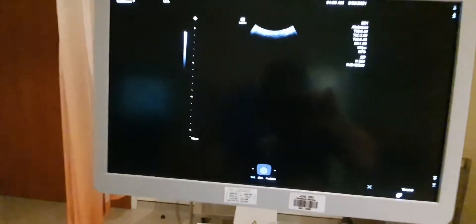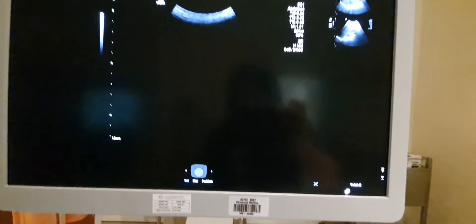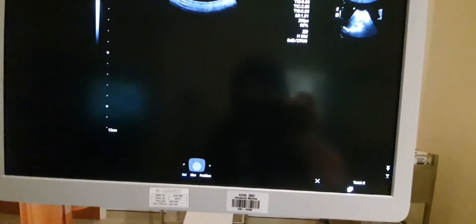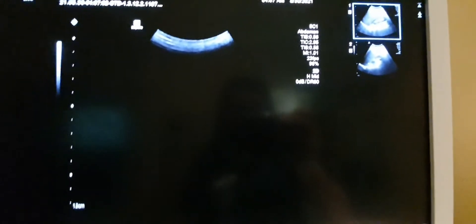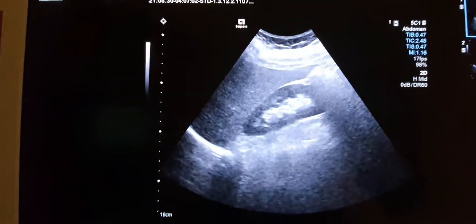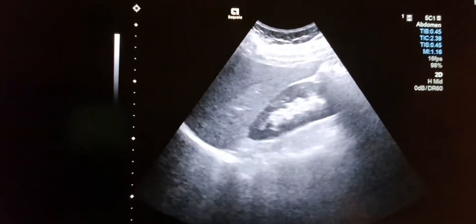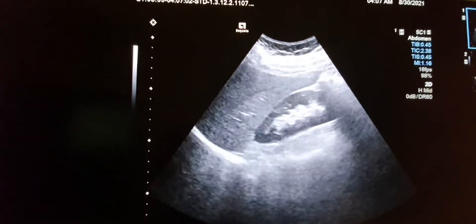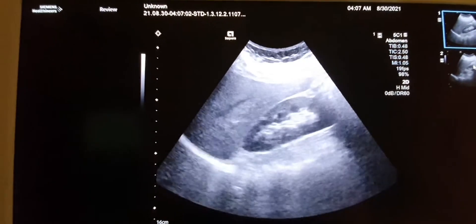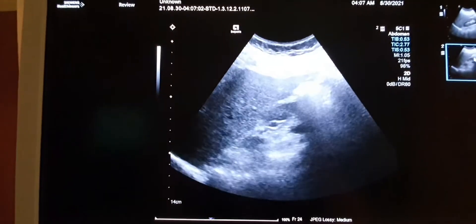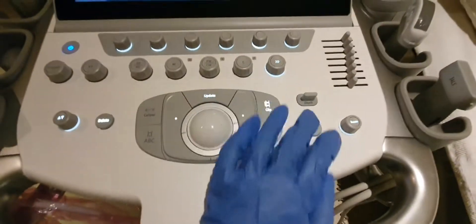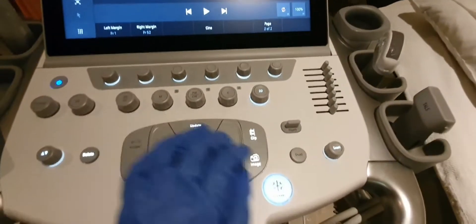Now let me show you how the depth is working. I recorded a video to demonstrate. As you can see, using the depth control adjusts the image — it's like a zoom in and zoom out. Here you can see my liver and my right kidney. That's how the depth function works.